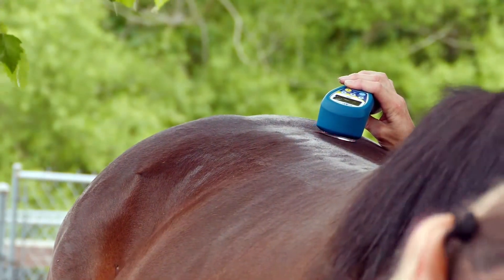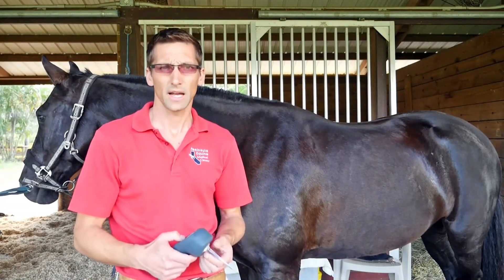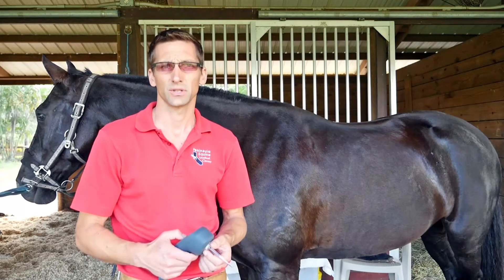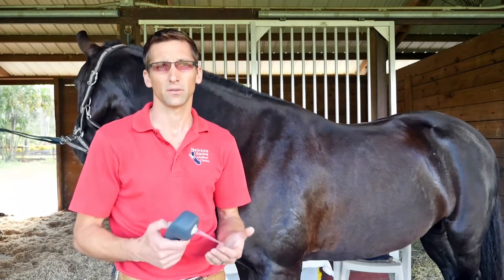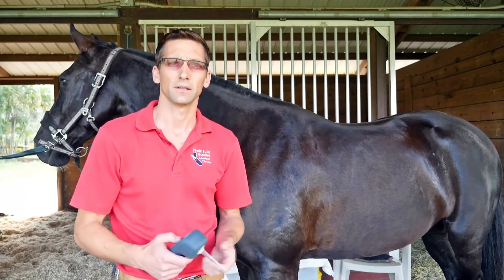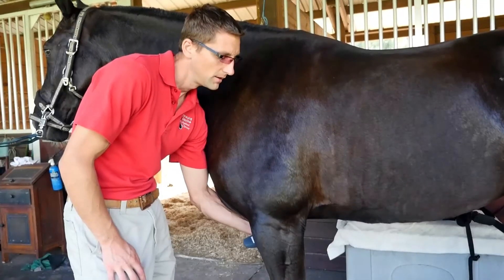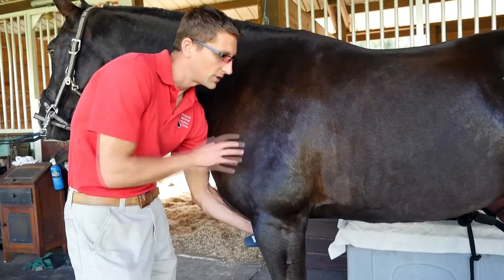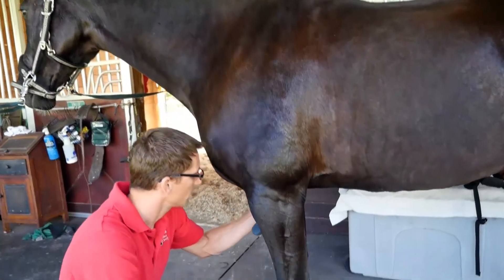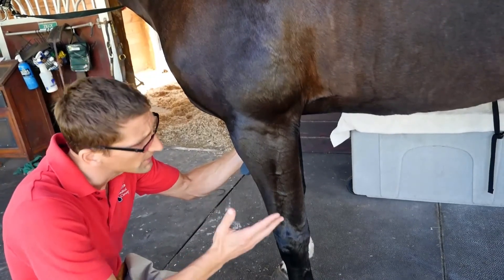Another application I always use it for is wound therapy. Whenever I have a laceration that needs suturing, after I clean it and before I suture it, I laser the area to start the healing process and take advantage of the antibacterial effects of the blue light. Edema or cellulitis is also an application I like to use it for, especially in horses in a subacute or chronic state that don't seem to be responsive to medicine — I've seen good results applying the laser to those cases.